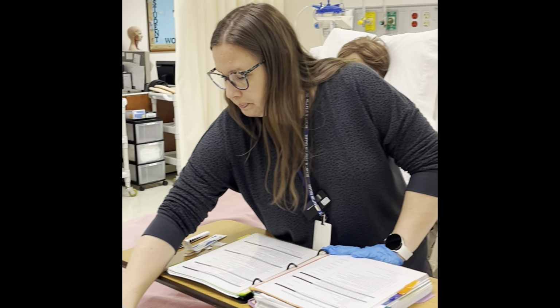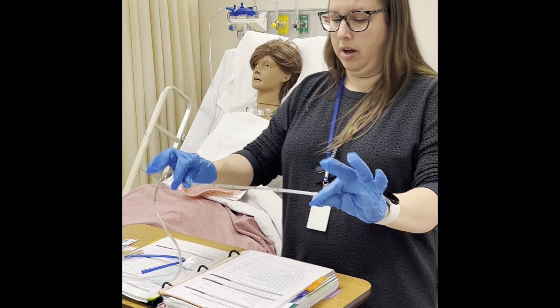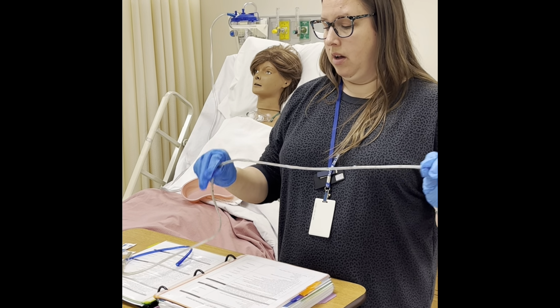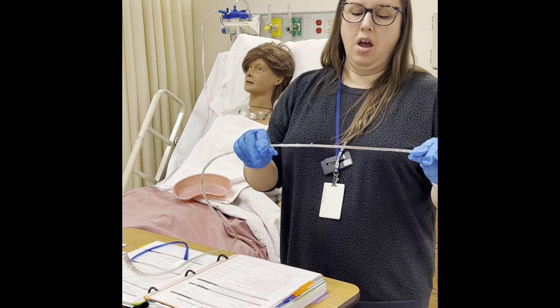Now we're gonna take our tube. Our tube should have measurements on it. There are some tubes in here that have no measurements, which is fine. I think I'm gonna take this one home because there's just so much tape on it from my students yesterday.